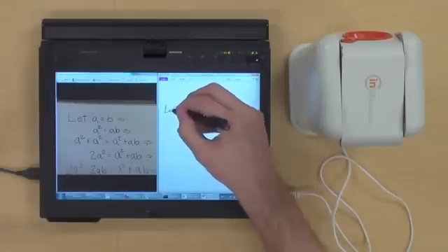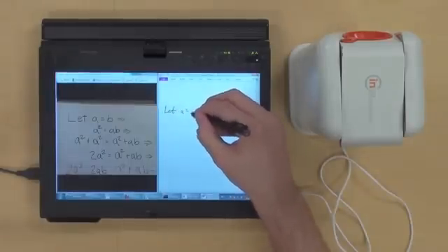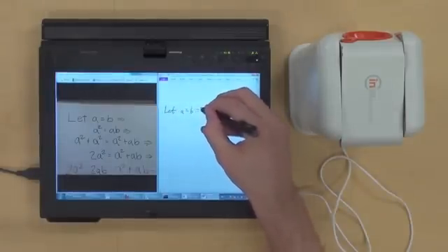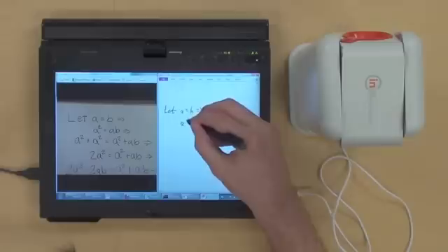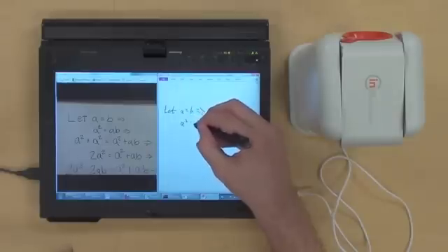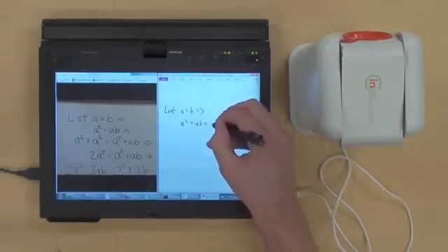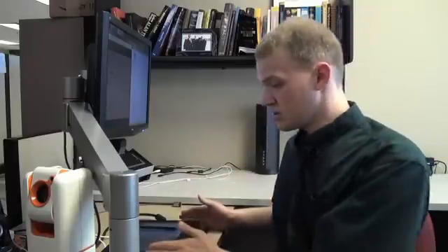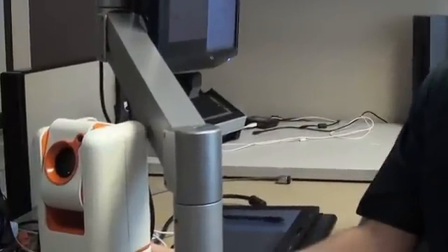So the note taker works by providing a low vision student with a view of their notes and a view of the board at the same time on a split screen interface on a tablet. You have this tablet here connected to it is a custom design pan tilt zoom camera.